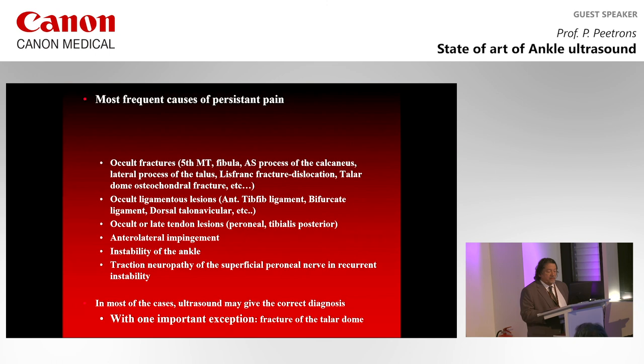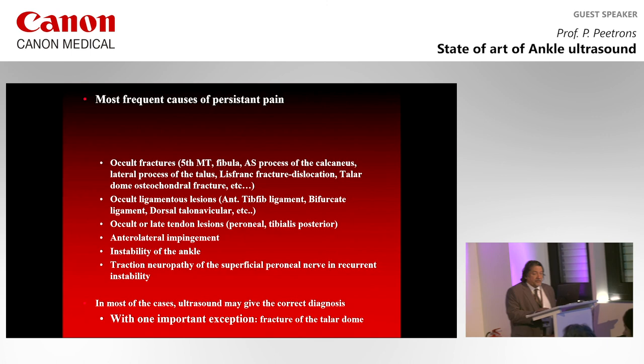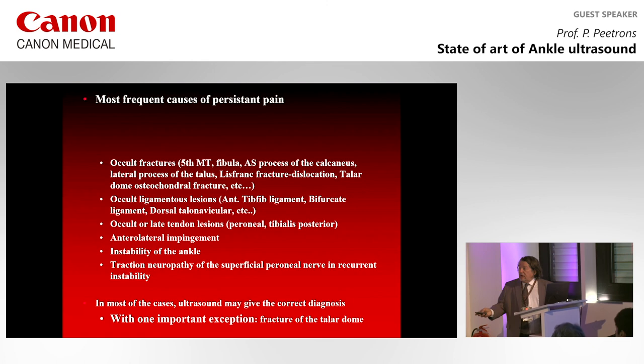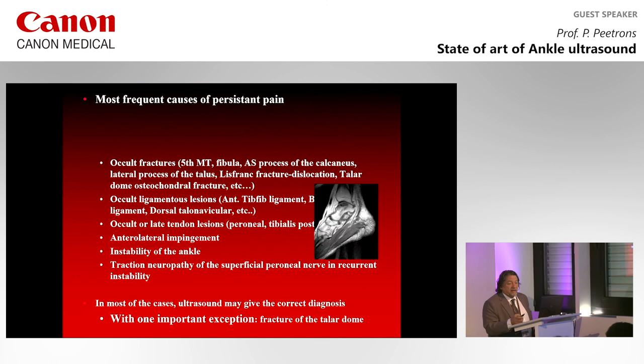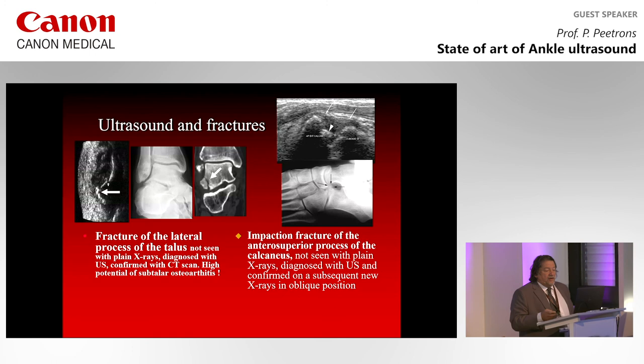But the only important exception that you cannot see with ultrasound is the fracture of the talus dome. So don't forget this. It is very important to do MRI when you have a discrepancy between a normal ultrasound and pain in the ankle after an ankle sprain.